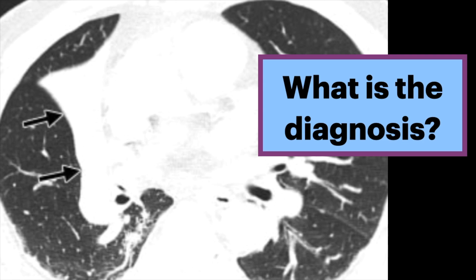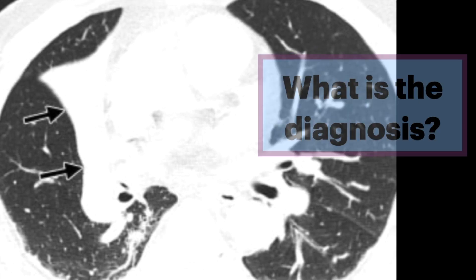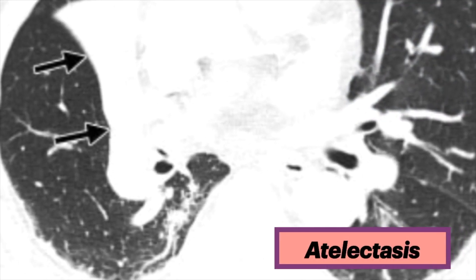What is the diagnosis? This CT on lung windows shows increased attenuation in the affected part of the lung with volume loss. Note how the fissures are tethered inward towards the opacity. This was atelectasis.